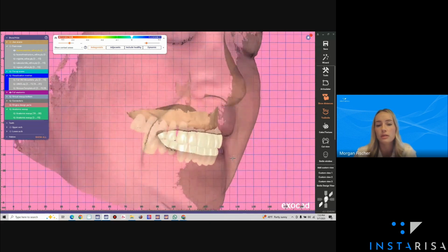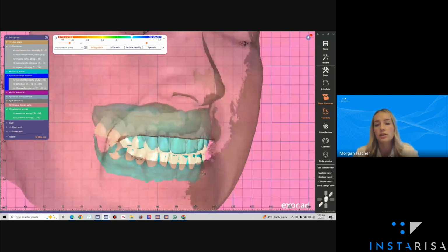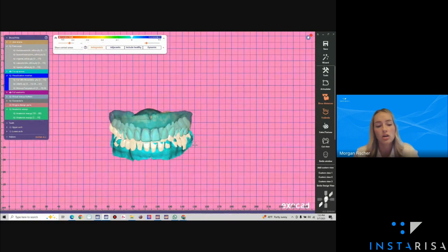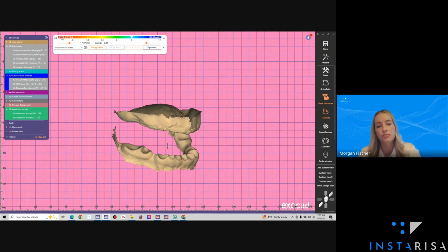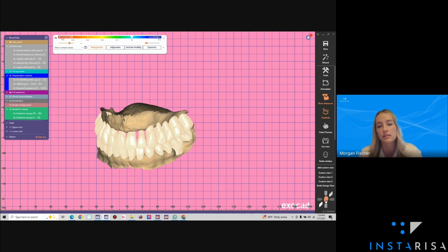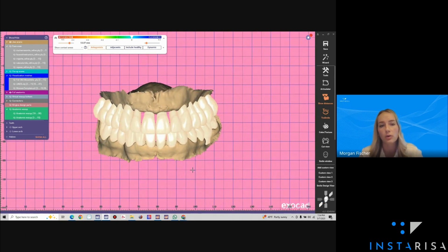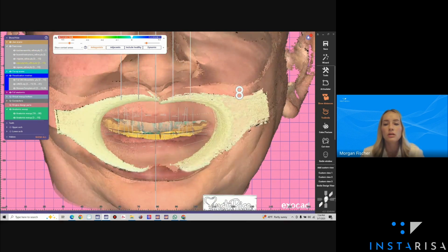Like I said, he'll be doing a putty matrix on this patient. So I just virtually extracted all of the lower teeth here. Preoperatively, that's what it looks like. Once I take it away, it's going to look like so. And then this is where I have my wax up for my teeth. We have a couple of edentulous areas, so we'll be bridging those or placing lower implants in the future.